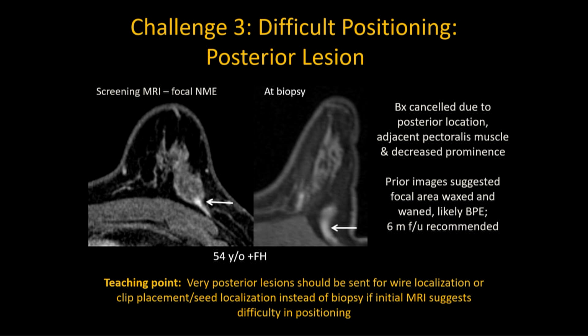So this biopsy was actually canceled because of the posterior lesion, pectoralis muscle, and in fact, the radiologist thought there might be some decreased prominence of the finding. So they reviewed all of the prior imaging and felt that it was waxing and waning and likely BPE, put it in a 6-month follow-up, and it was no evidence of disease to date.